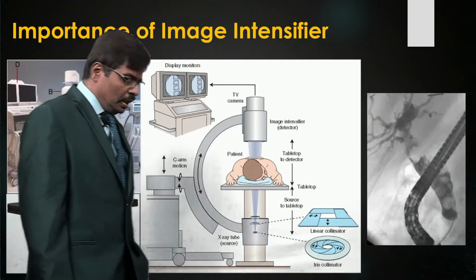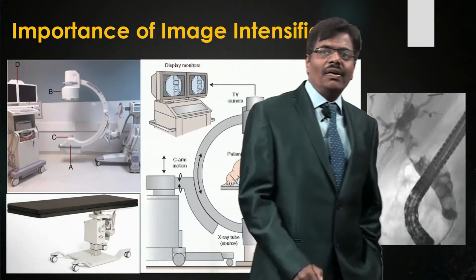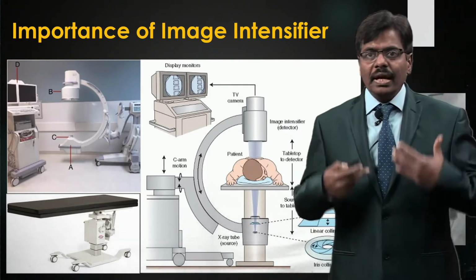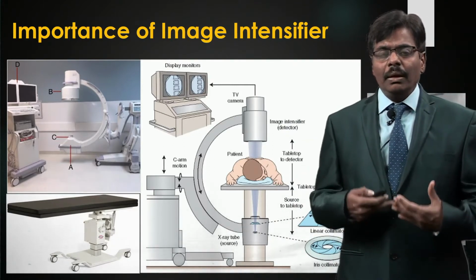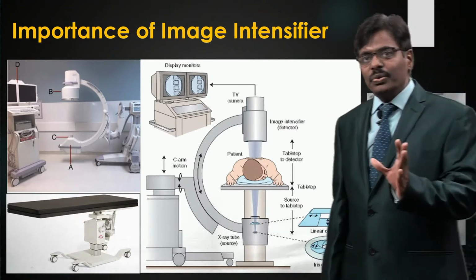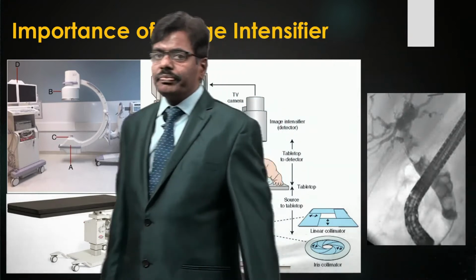And I also told you last class regarding the importance of the image intensifier, how it works, and the gear you need to put on in order to protect yourself. Lead apron, thyroid cover, goggles, all are important not only for you but all your staff should wear them.